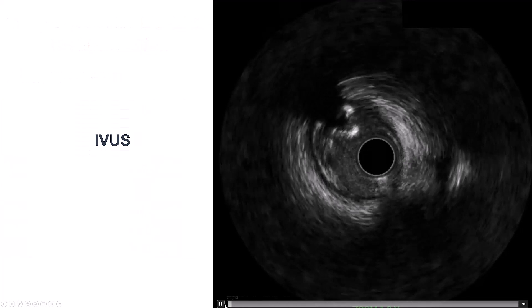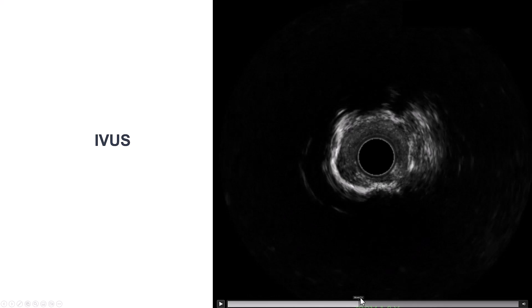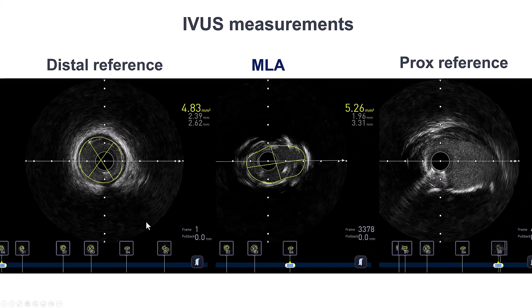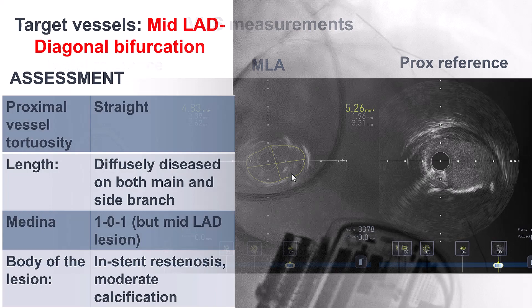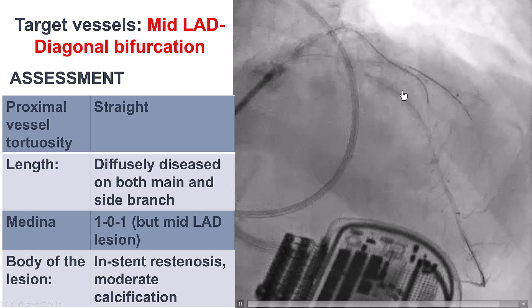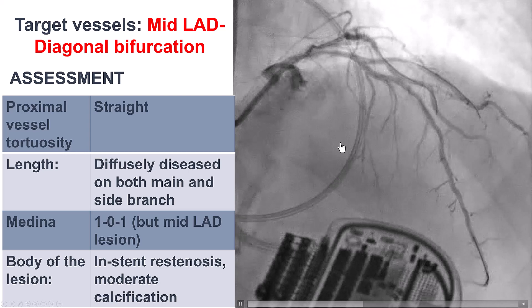This is intravascular ultrasound that demonstrates diffuse disease. We do have the previous stent. There is significant calcification and significant stenosis. Coming back all the way to the left main, which is also fairly heavily calcified. We have significant disease. This is the other bifurcation — we have disease into the proximal LAD and disease into a diagonal branch. The mid-LAD actually appeared to be okay, but there was significant disease in the diagonal as well as the proximal LAD.